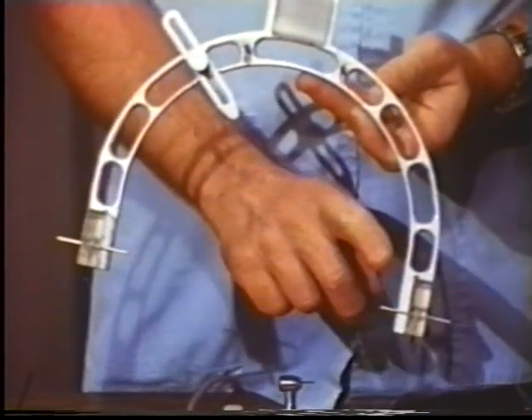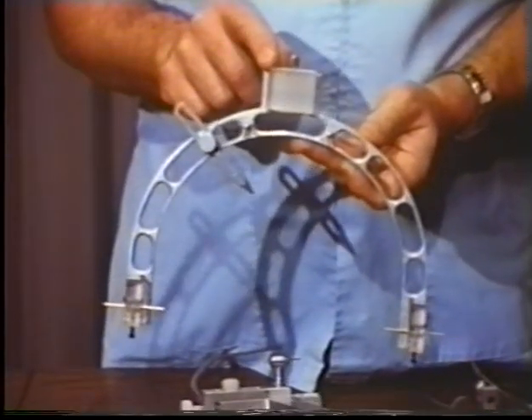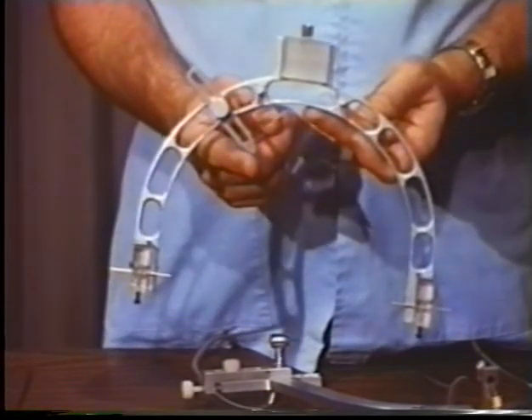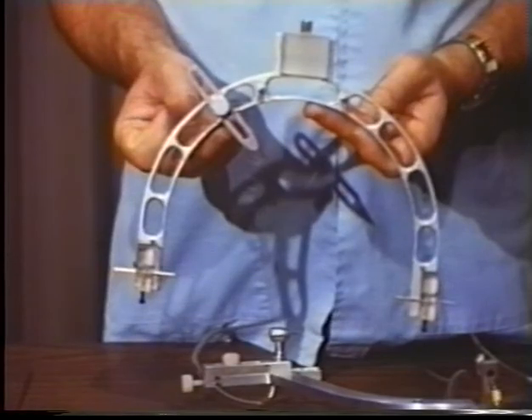2 of the recording blocks cover the region of hinge axis movements, and the third is centered in front of the face. A pointer located on the right side of the bow orients the recordings to the orbital axis plane of reference.